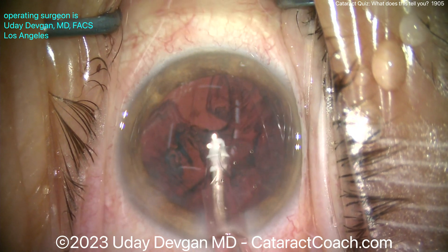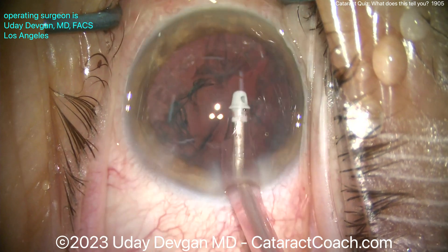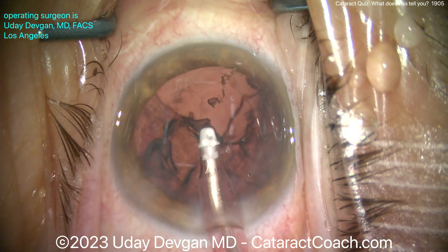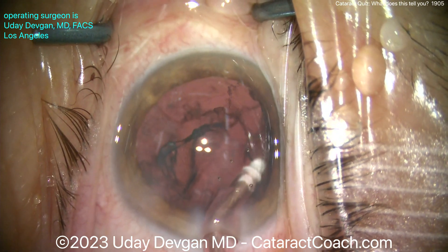Stay away from that area — don't start at that area. The zonular weak area is at about the 10 o'clock position. So we'll start here at 12 — that's okay — and I'll go over here to 1, 2, 3 o'clock. Let's remove cortex.